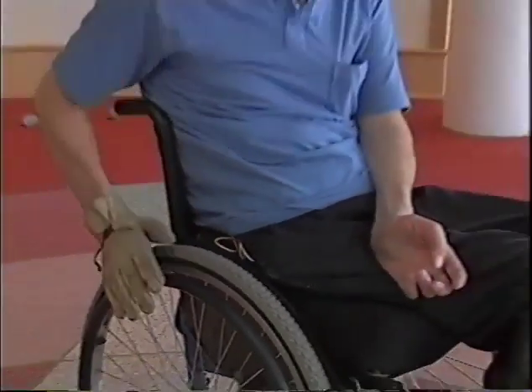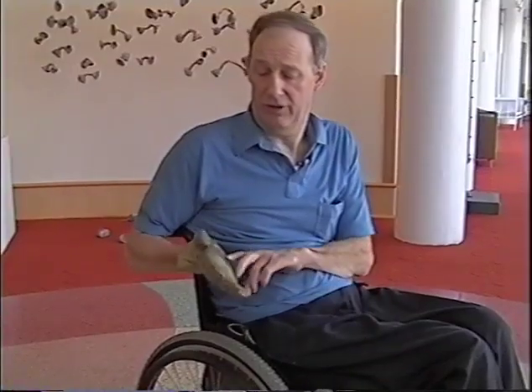So the wheeling techniques are the same as for the paraplegic, and you can substitute. Get yourself some leather gloves and knobby tires, and I think you'll find that these with a completely broken pattern on them are wonderful.